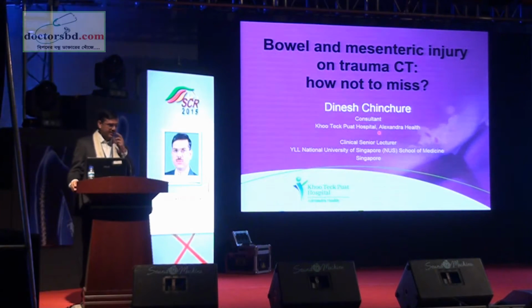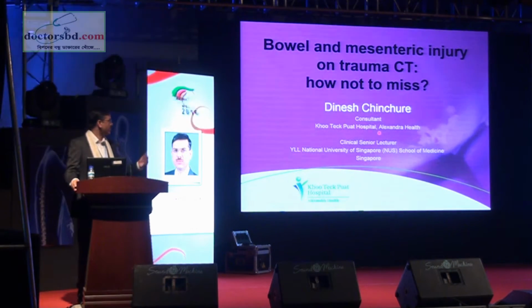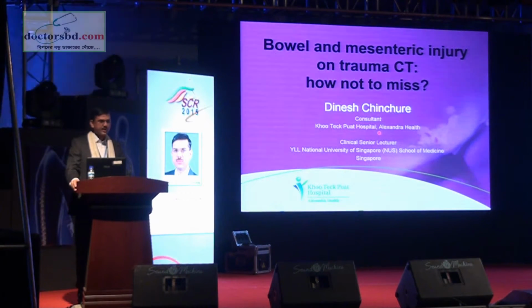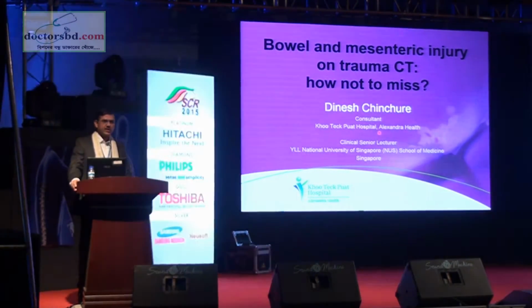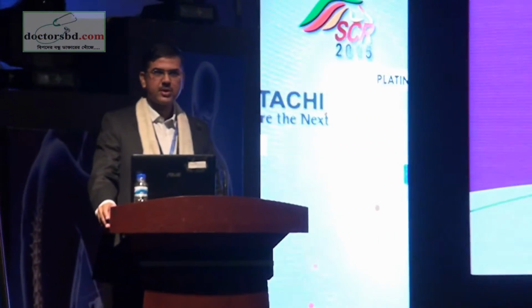I have, as the Chairperson told, two topics. One is bowel and mesenteric injuries on the trauma CT, and the second topic is about MRI in rectal cancer. How do we stage, and what's important for the surgeons?